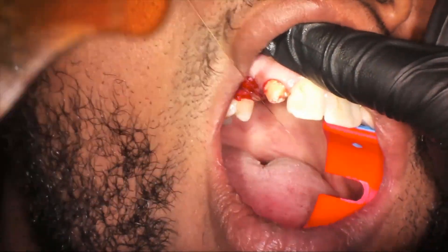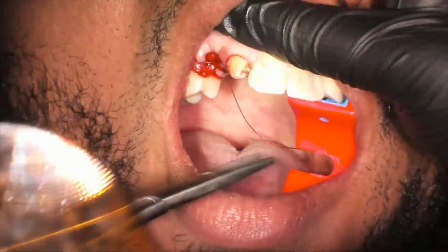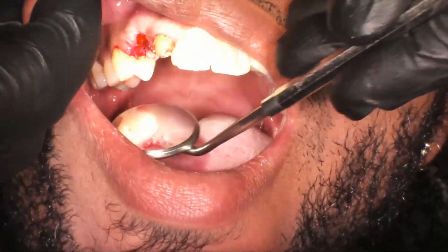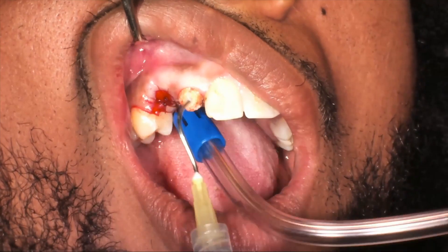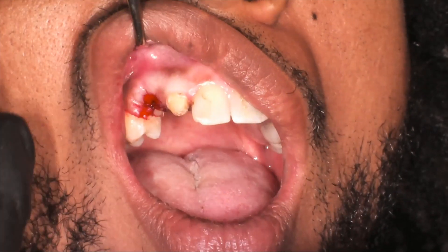We placed a collagen plug above the bone. Typically I like to put a PRF plug, but in this particular case with this draw, we didn't get a good plug to use, so we went with a collagen plug. Here is a close-up of our extraction site done — we clean everything off and make sure that the bleeding is stopped.